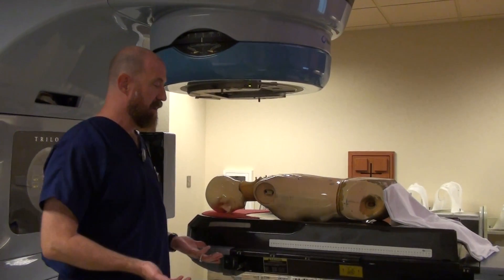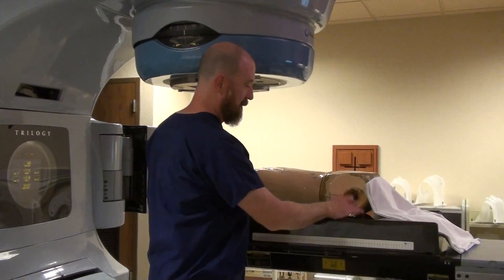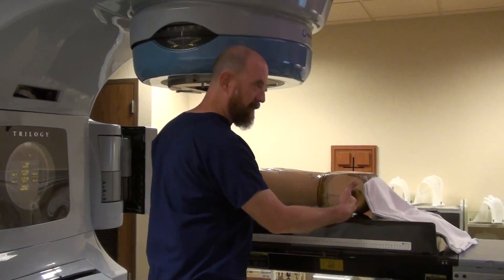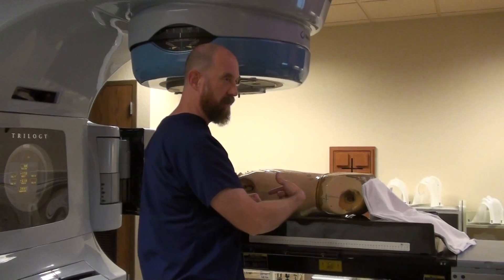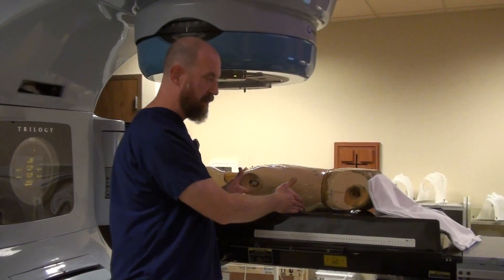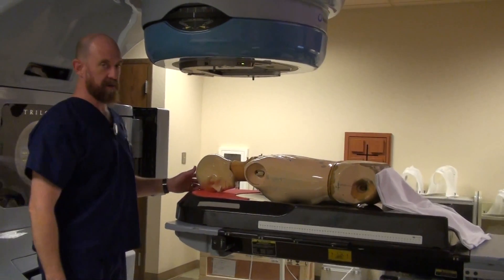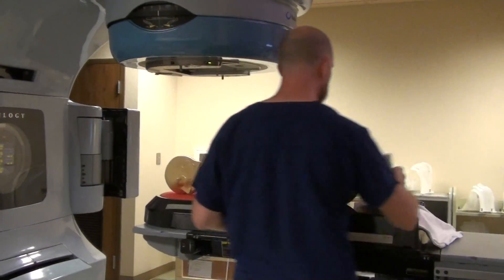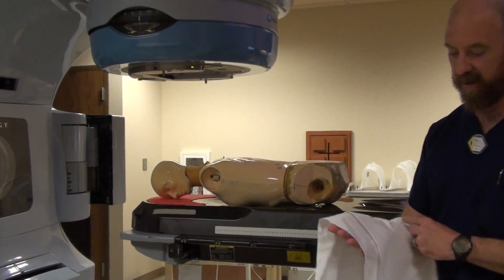Those are the most important things. Once again: symphysis at the superior edge of the inferior portion of the belly board — not further down, not further up. The pelvis doesn't need to be in the hole. When you actually do an actual treatment, you're probably going to have a sheet underneath the patient.